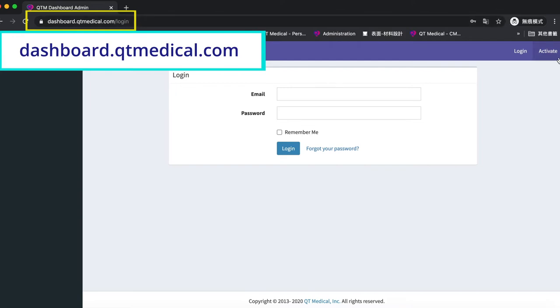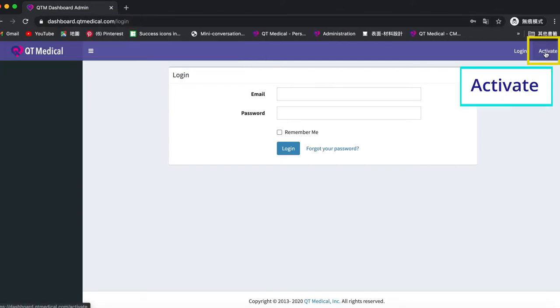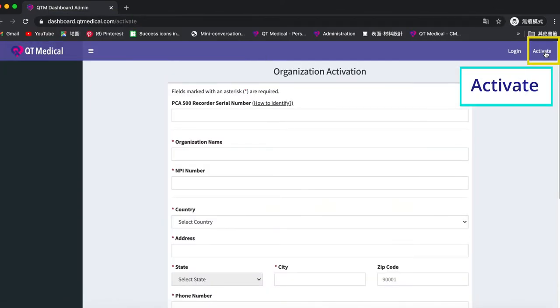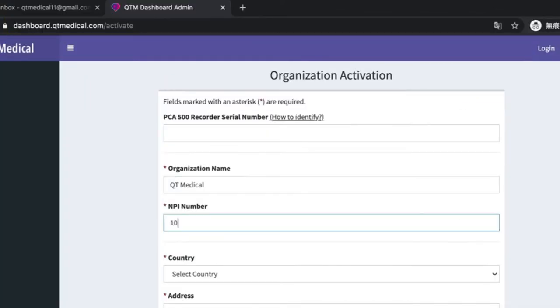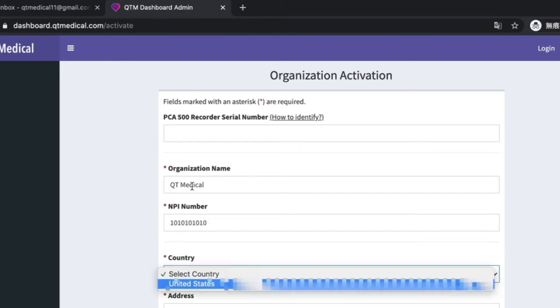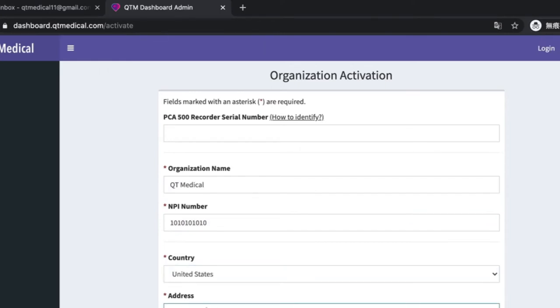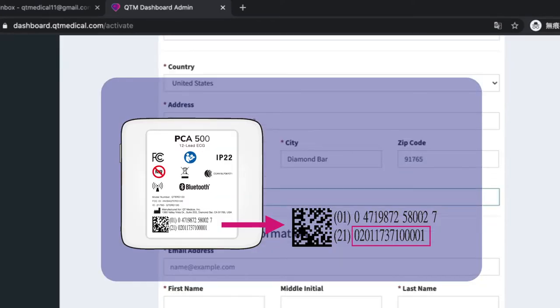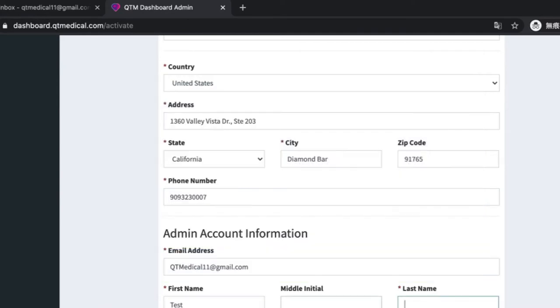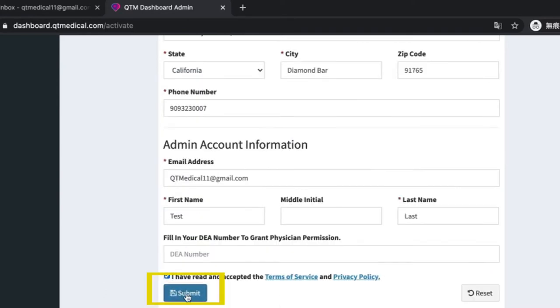Click activate at the right upper corner. Input the required information for your organization. The serial number on the device can be found on the back of PCA 500 as shown here. Once you've hit submit, look for an email from QTM web service.